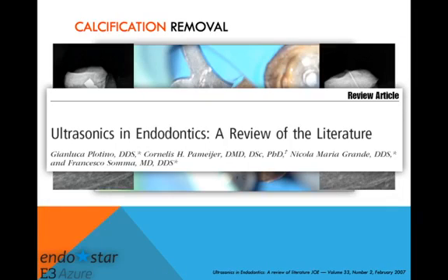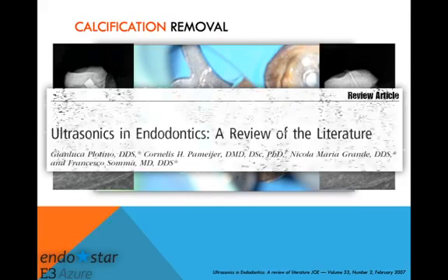Coming to calcification removal. When it comes to calcification removal, literature has shown us that calcification always proceeds from the orifice, or from the coronal third of the canal, to the apical third of the canal. Therefore, I can't practically take a diamond burr and my high-speed turbine and go through the calcification and locate the canal. So ultrasonics is the only answer to removal of this calcification.